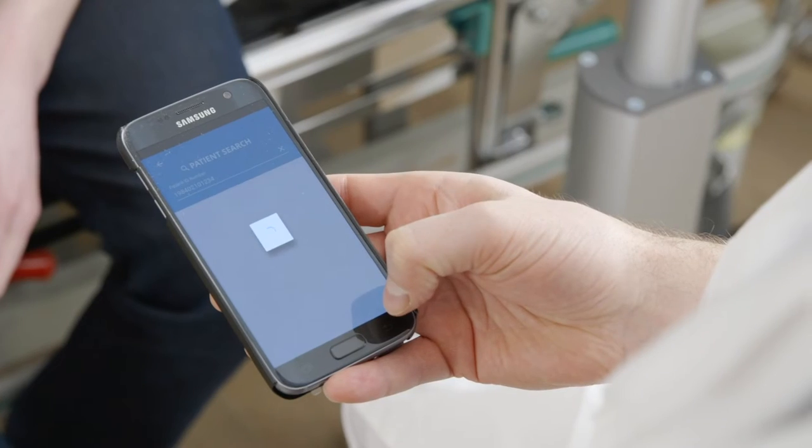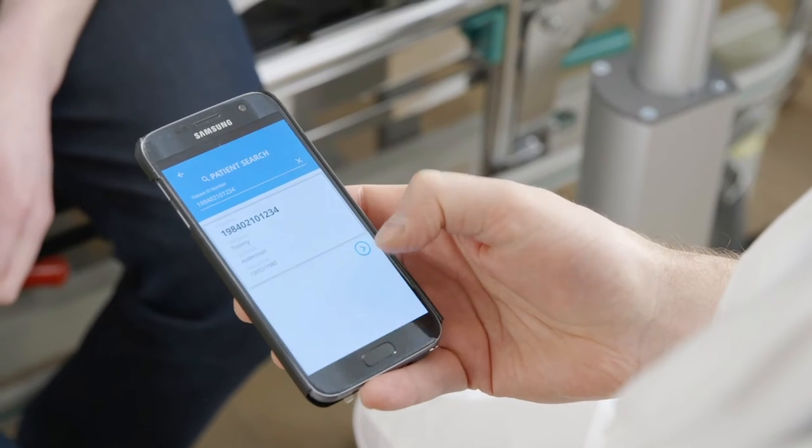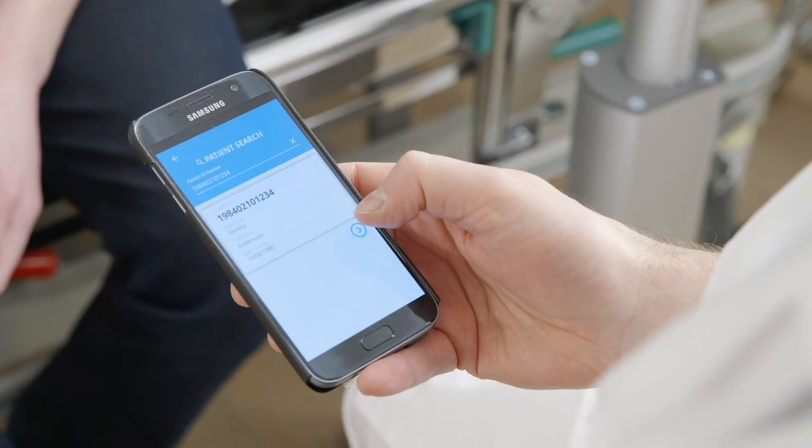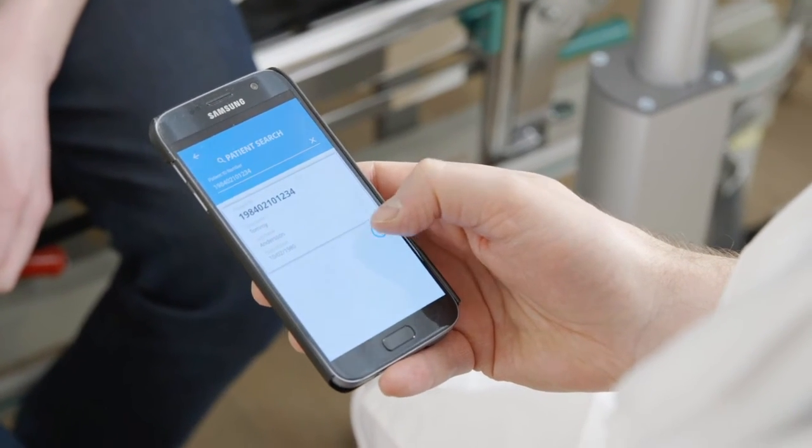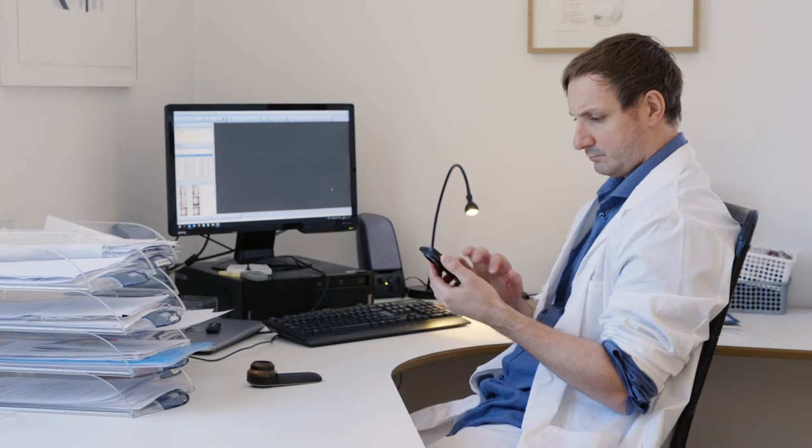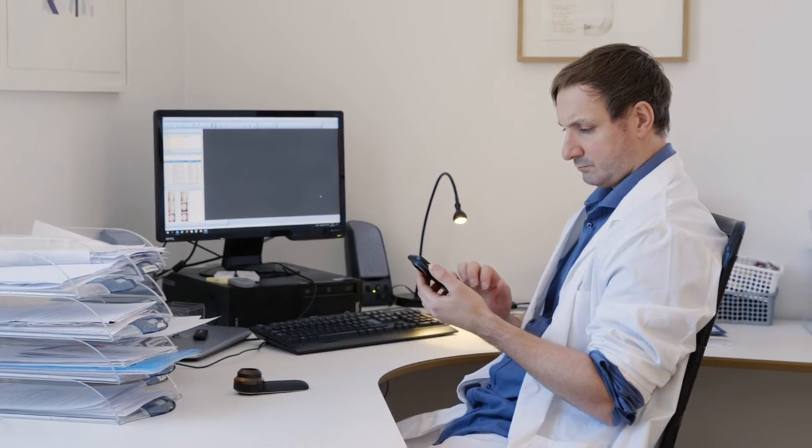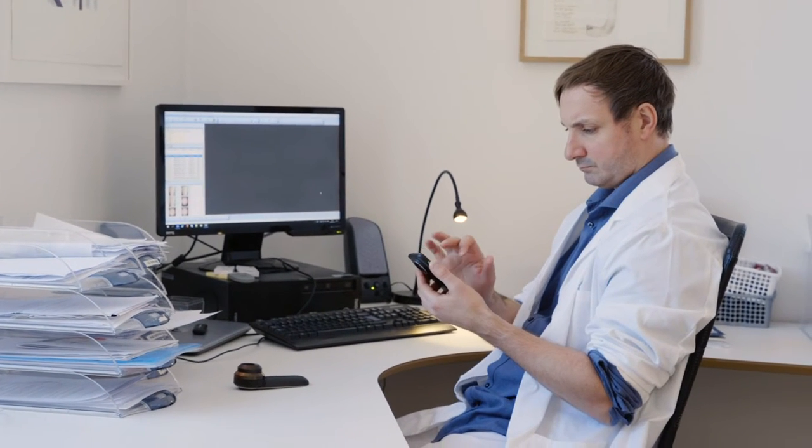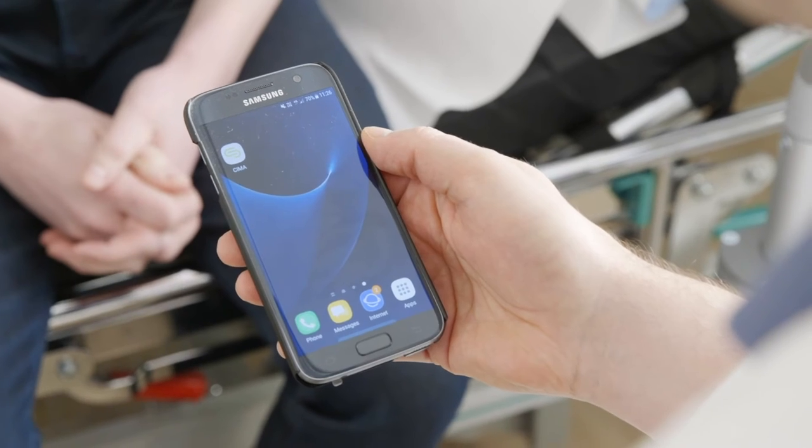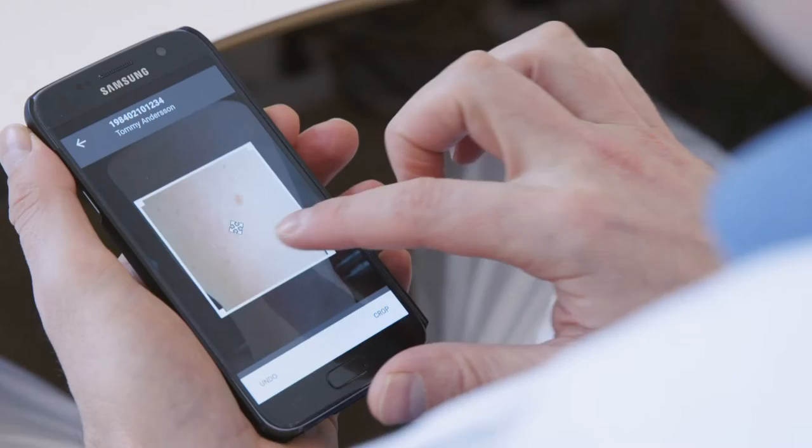With CIMA, it's easy to capture and send medical media using a mobile device. The app features a user-friendly interface, allowing healthcare professionals to take a photo or video with the touch of an icon.